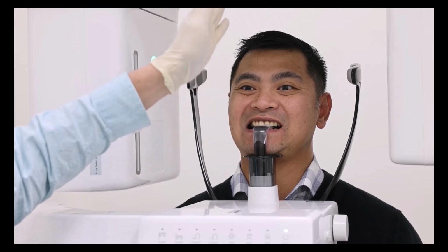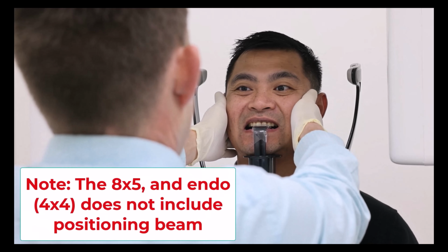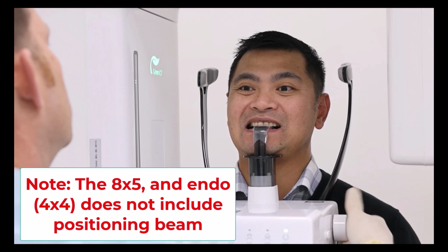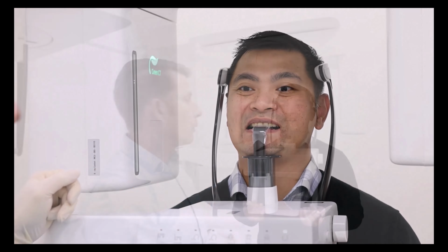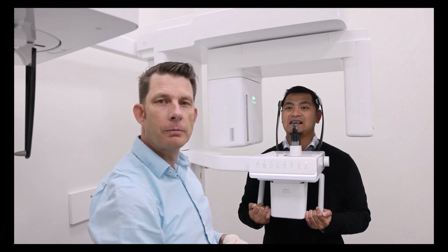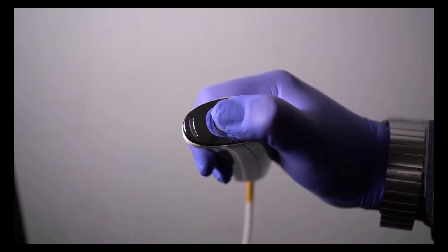Next, I want to make sure they're lined up center. So I'm going to make sure they're lined up center here. Go ahead and close my temple supports. We're going to step out of the room and take our 4x4 scout image. Hold the button until the image acquisition is fully complete.